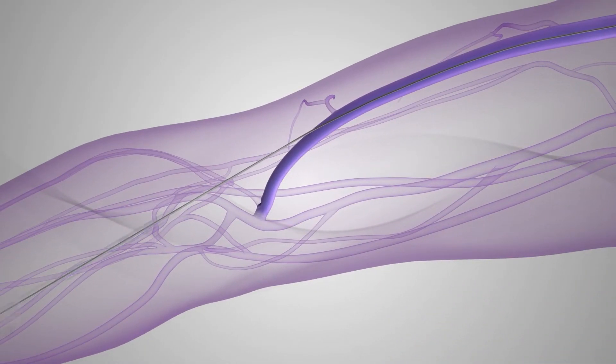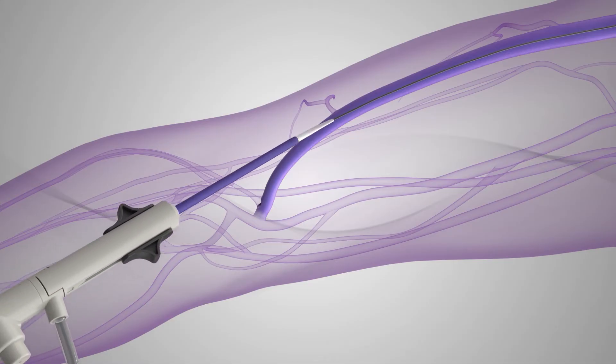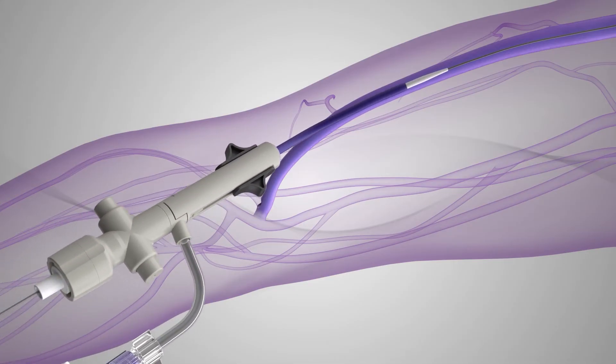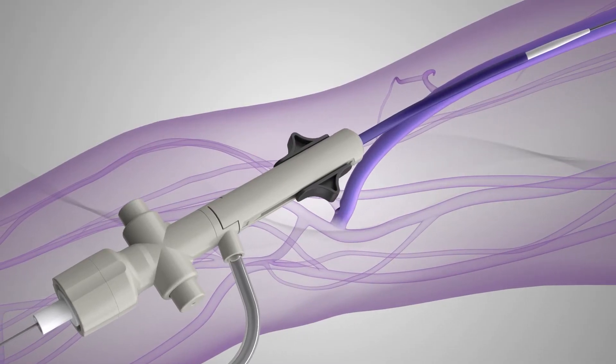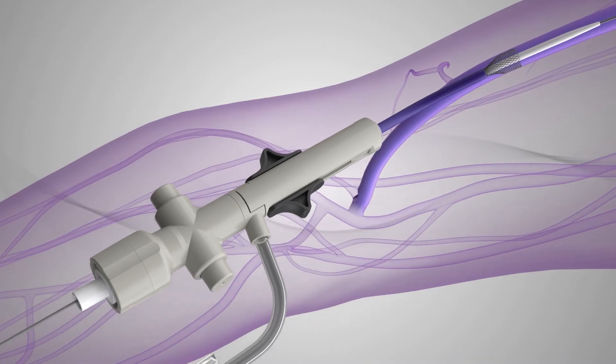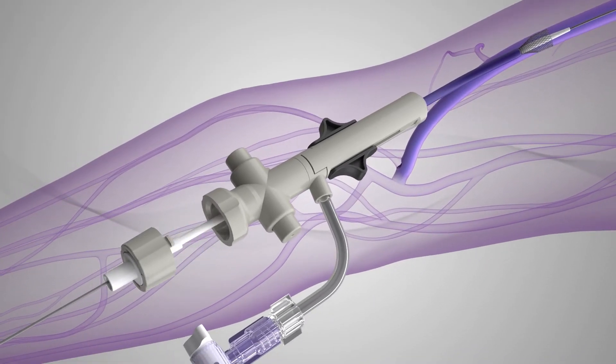The sheath with the dilator is introduced over the guide wire and inserted at a 45 degree angle, and carefully advanced until the dilator's tip is proximal to the thrombus. Once access is gained, the sheath funnel is deployed by retracting the black tabs into the proximal position. Then, the dilator is removed by twisting and pulling the dilator cap.